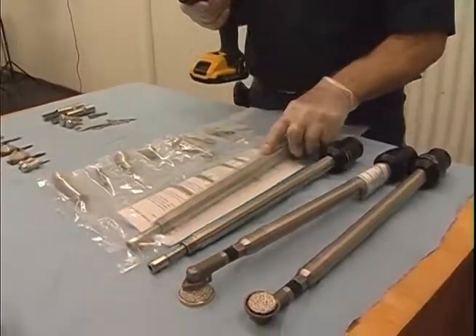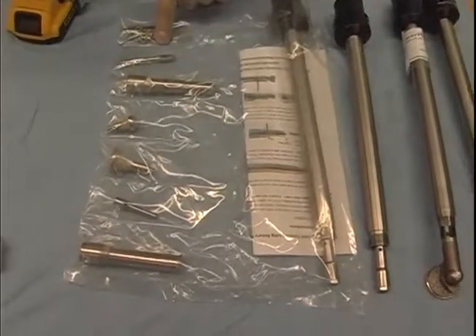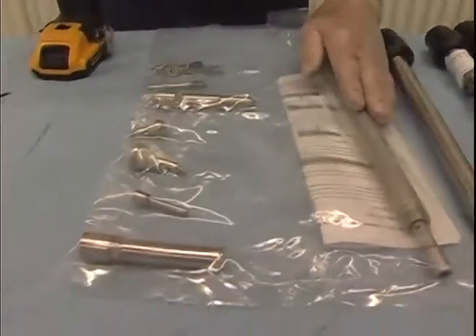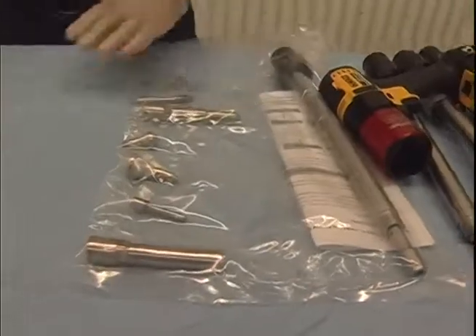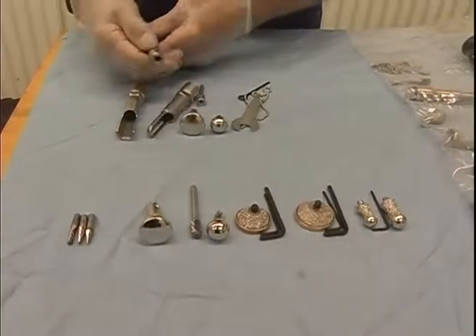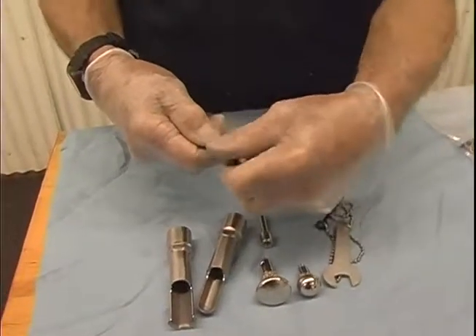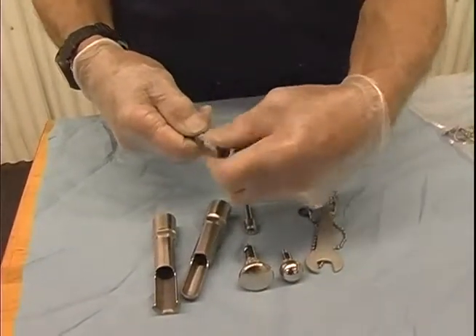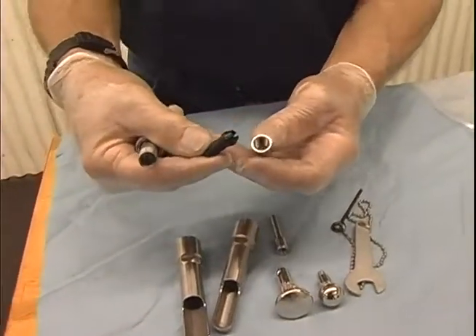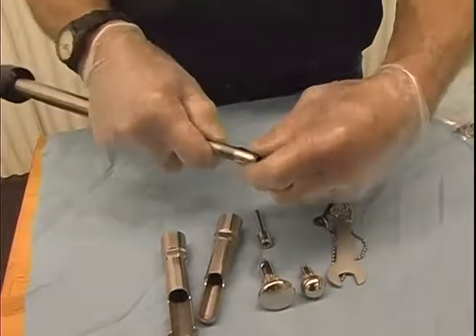This shaft is sold with these three major connections at the end. It comes as a package, and I'll show you how each one goes onto the shaft from this group over here. So this is the shaft, and on the end of the shaft there is a nut which can be unthreaded, and inside underneath this nut cap is a collet to grasp onto a shaft. So we simply put the collet back on.